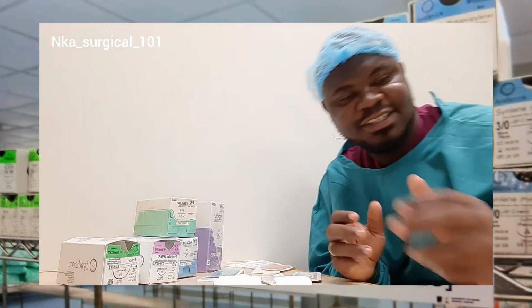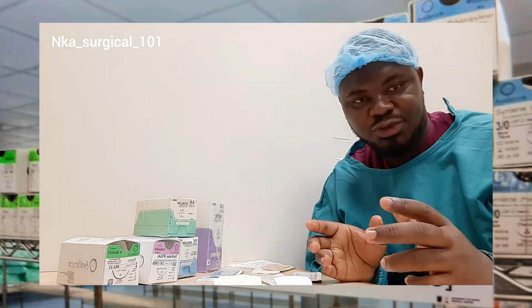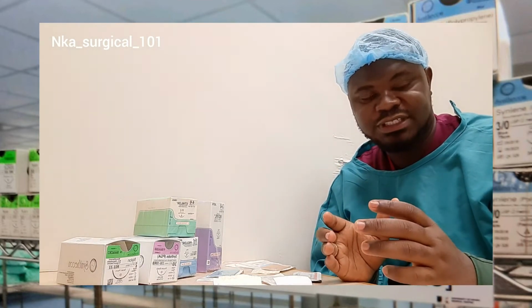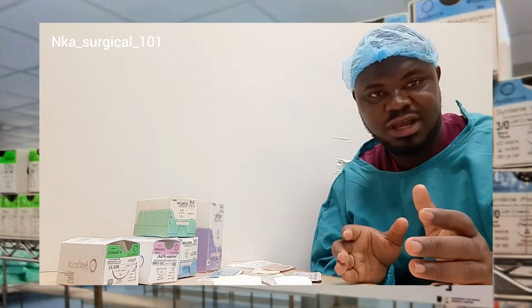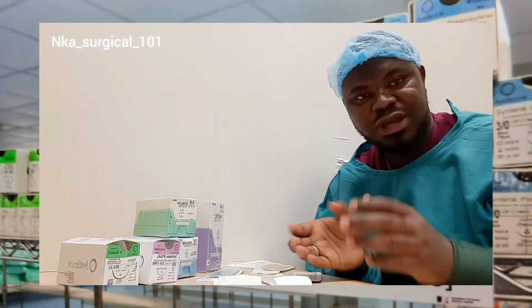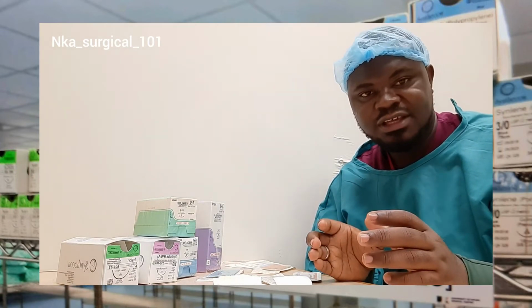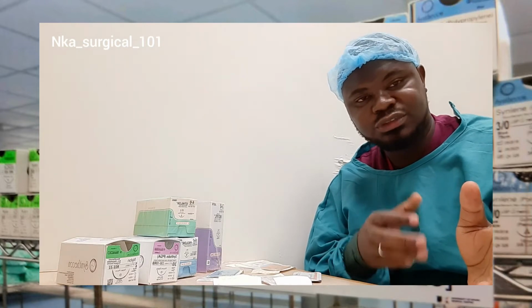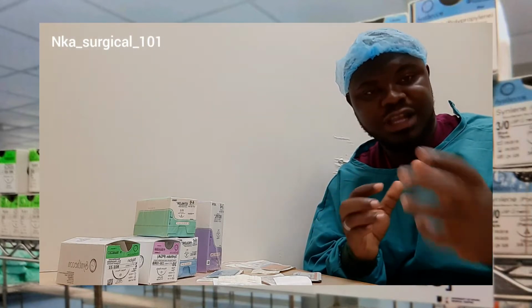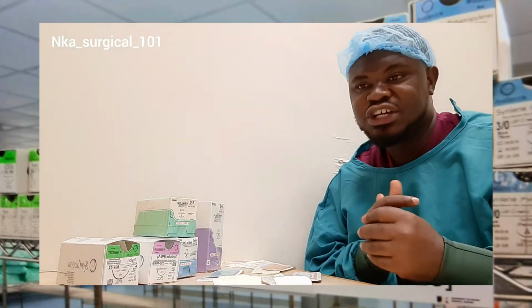So as already discussed, there are two main categories of sutures. We have the absorbable and the non-absorbable sutures. And under each of them, we have the synthetic and then we have the natural. So we have synthetic absorbable suture and natural absorbable suture. Same as with the non-absorbable, synthetic non-absorbable sutures and then natural non-absorbable sutures.